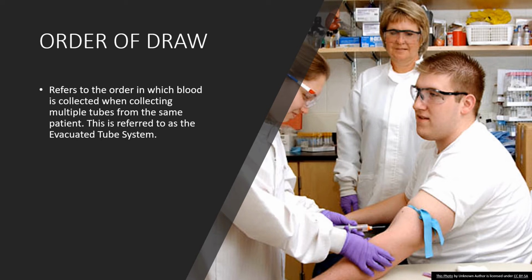And if you'll notice this picture we have here on this slide, there's a gentleman that is seated with the tourniquet tied around his arm, and there is a phlebotomist or a phlebotomy student in front of him. Of course, she's wearing her gloves, and in her left hand, the hand further away from the front of the slide, she has an evacuated tube system. Now, we'll go over this in lab class and in other presentations, but what's included in the evacuated tube system, you can see this, is a needle that is attached to what looks like a clear plastic tube, and that's your evacuated tube holder, okay?